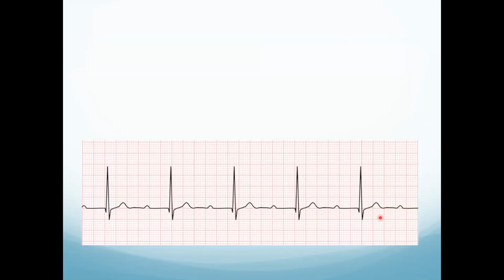Okay, we've got our last couple of examples here before we finish up. So now we're going to look mainly at conduction disturbances.